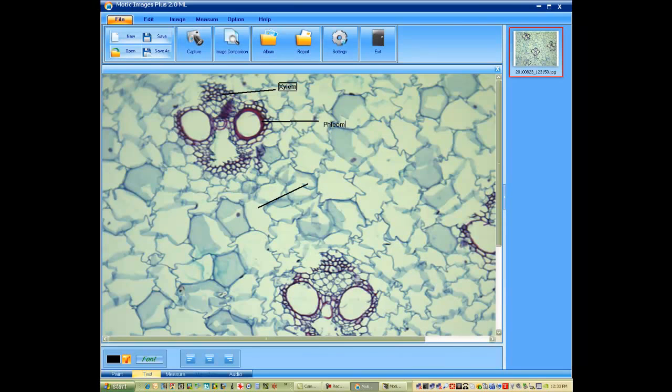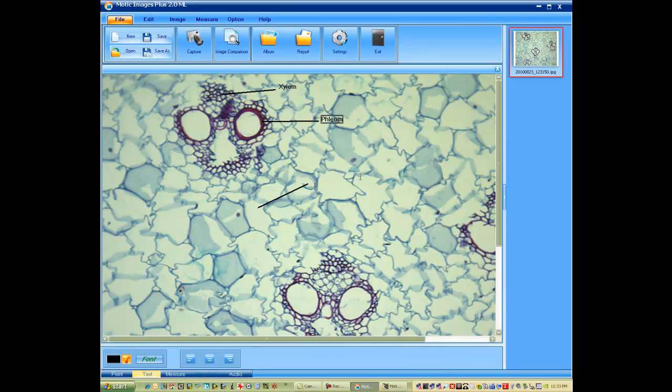And then again, you can move the new text box wherever you'd like in your image. And then finally activate your text tool again to label your, in this case, pith cells.